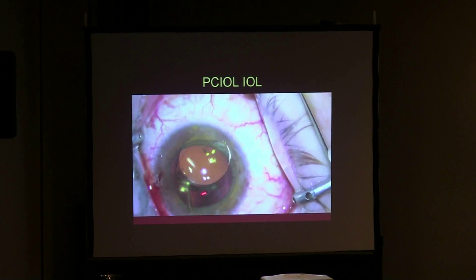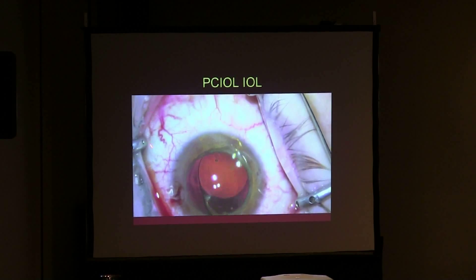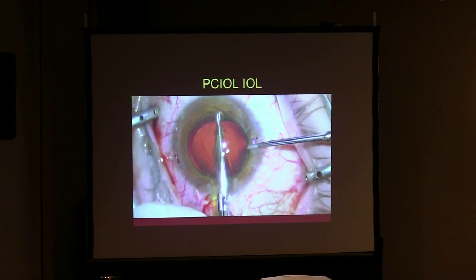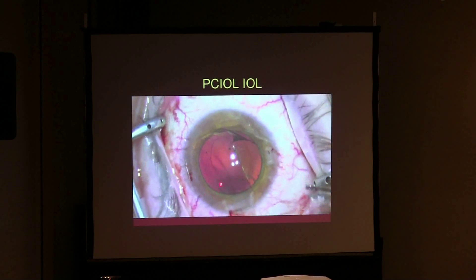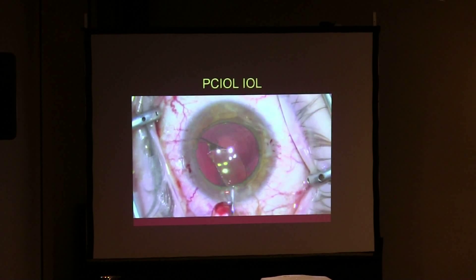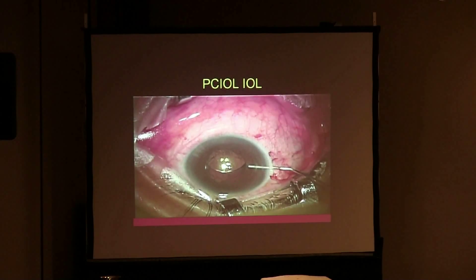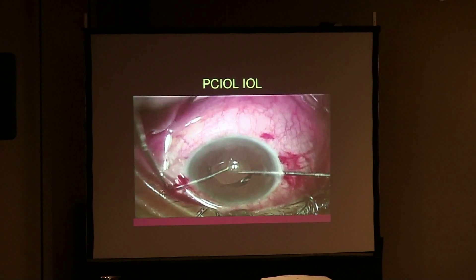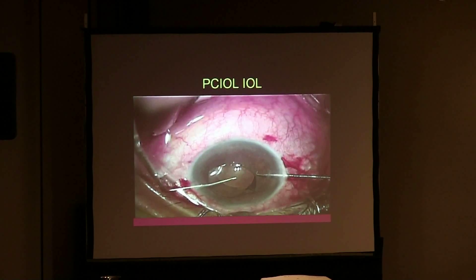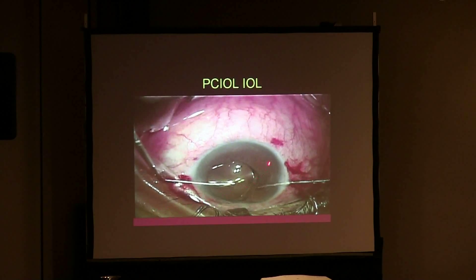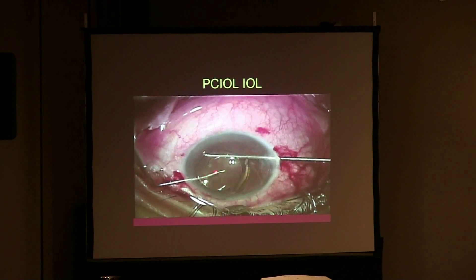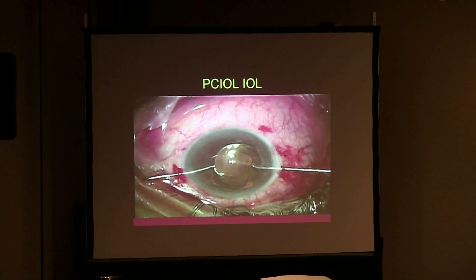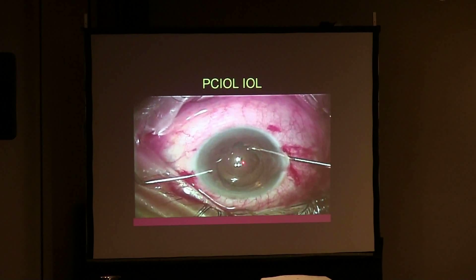The most important part is really to liberate the IOL and to bring it up to the anterior chamber. It's really good to know where your haptics are and just to rotate to the blunt edge, so you are not tearing the iris in the process. Here we know that the haptic direction is that way, so we're rotating around it to the blunt edge so we do not cause iris trauma.